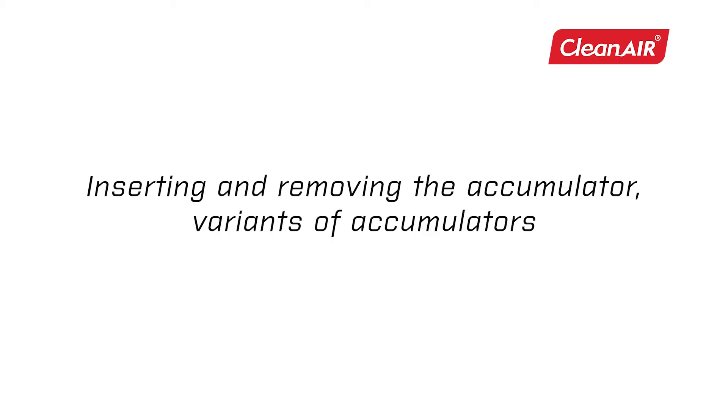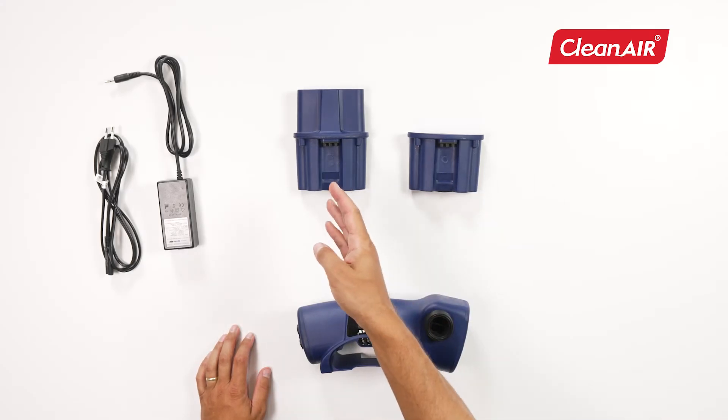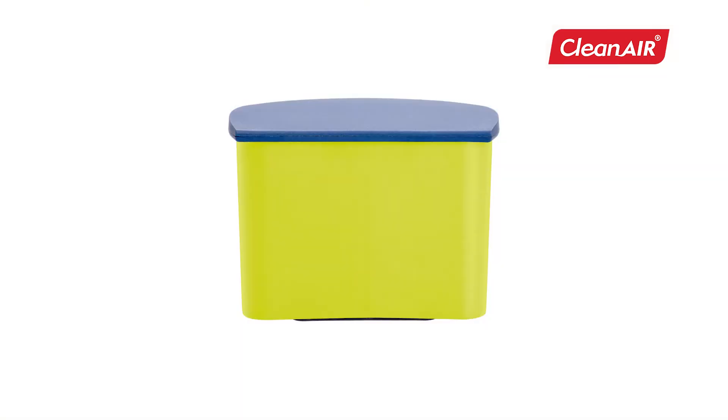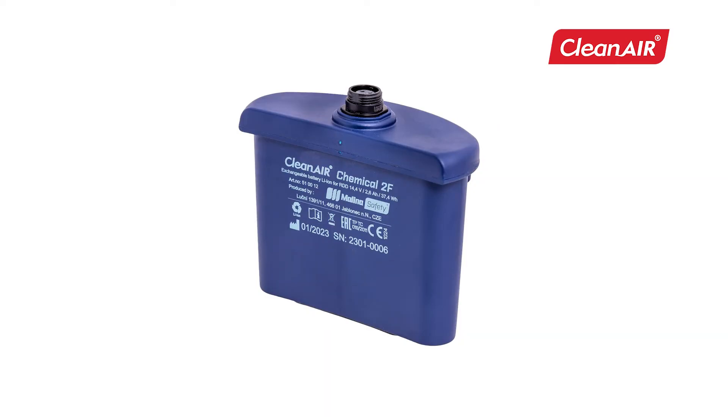Inserting and removing the accumulator — variants of accumulators. You can choose from a standard battery or a heavy-duty battery with increased capacity for up to 20 hours of operation. Clean Air also offers a non-rechargeable one-time use battery with guaranteed 10 years of storage time, or an adapter for operation directly from a power outlet and a battery with a connector for RDD connection.